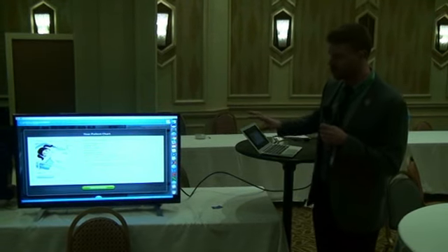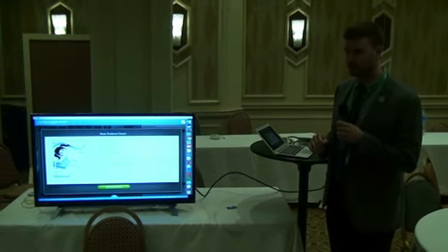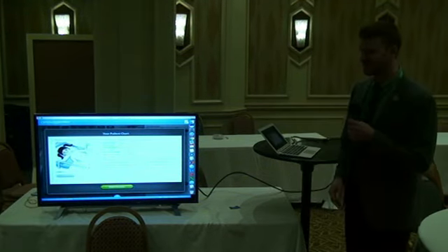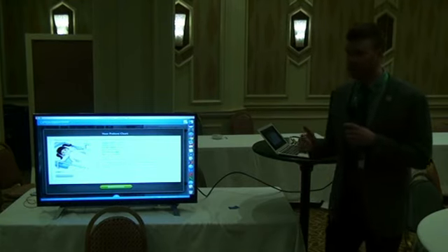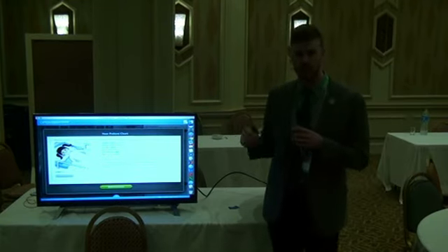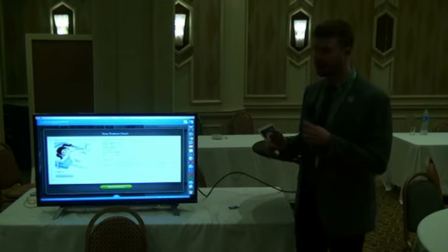What I'm going to show you, it's just to record. I'll just talk loud. So our time together here is going to be spent looking at the Virtual Ventilator. It's a piece of software. This is my little commercial.